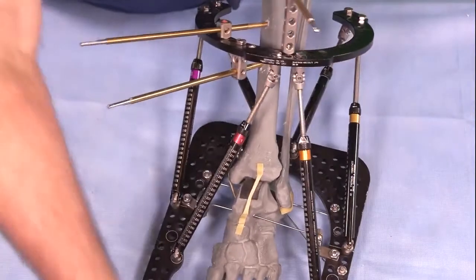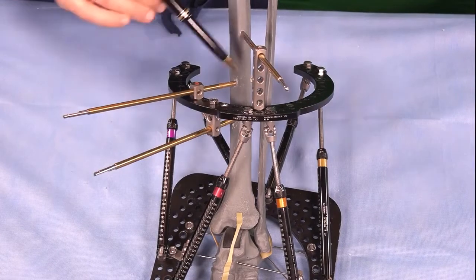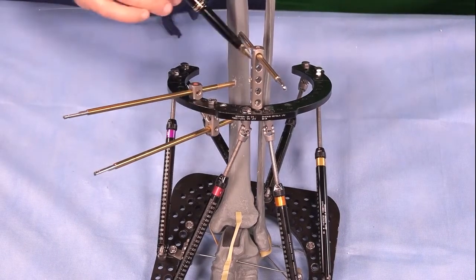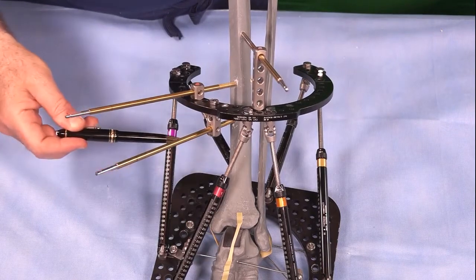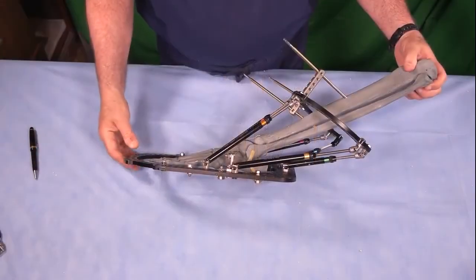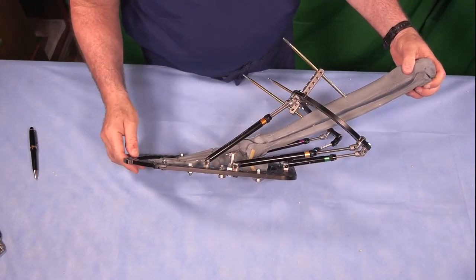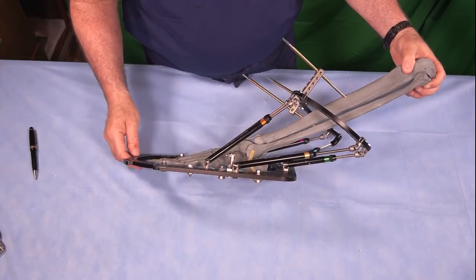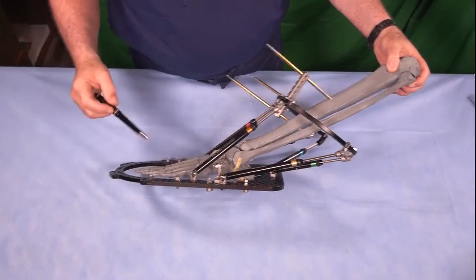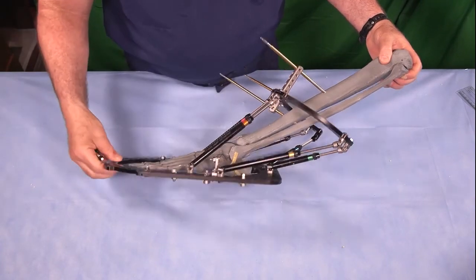In the tibia, I have a total of 3 points of fixation in a delta configuration, and they're all placed so they're not going to be in the way of the struts during correction. At this point, I'm going to make a notation of the strut lengths and sizes, and before we leave the operating room, we'll take an x-ray that shows the lateral view of the foot with the center lines.